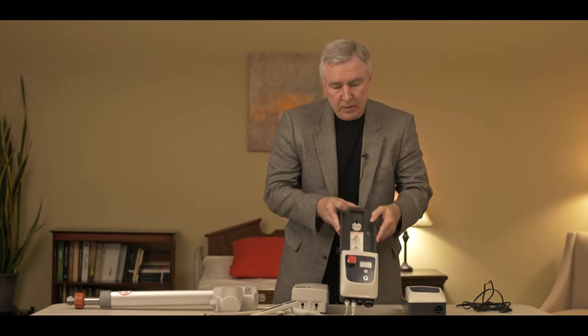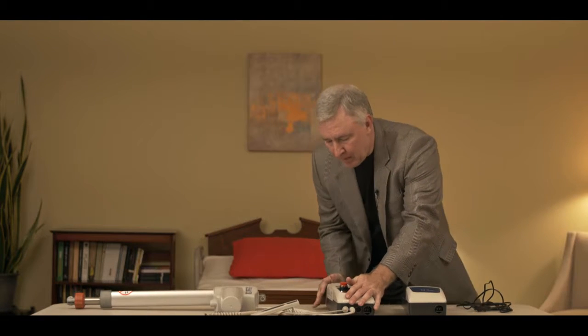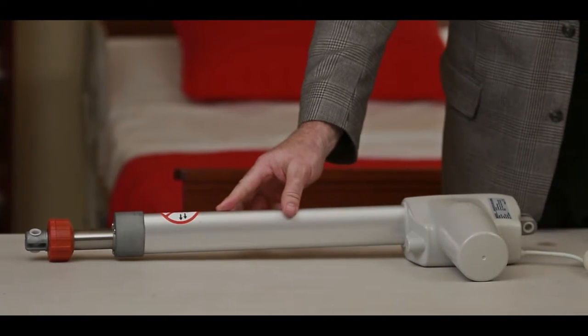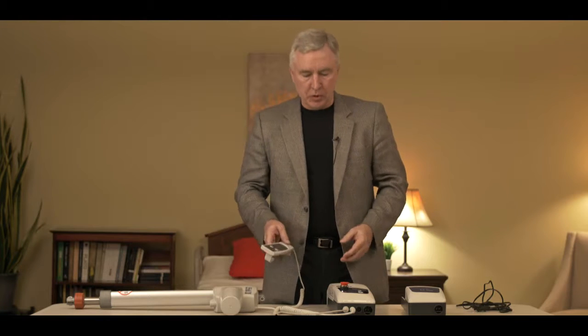Hey folks, Damian with BestCare. The purpose of this video is to help you troubleshoot your Style 2 BestCare electronics. Style 2 has a control box, and if everything was hooked up and functioning properly on your lift, you'd hit the up button, the motor would go up, the down button, and the motor would go down. Let's break down each of these individual components and talk about some of the ways to troubleshoot them.